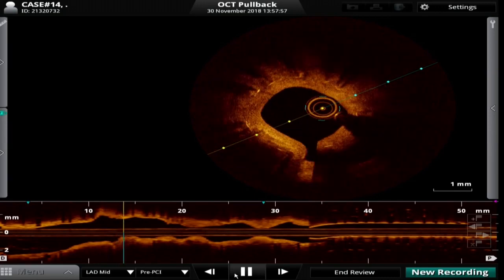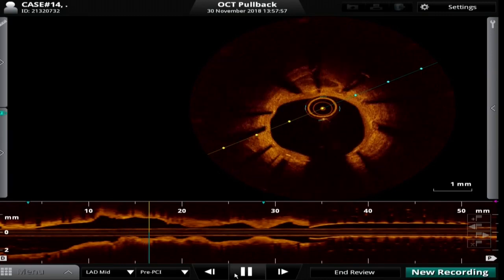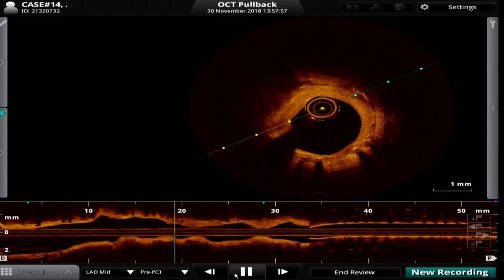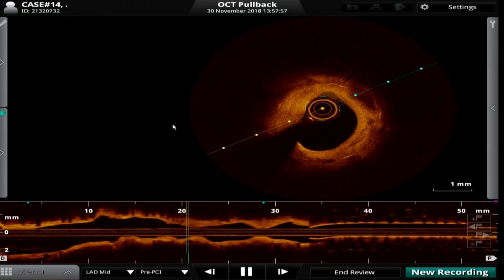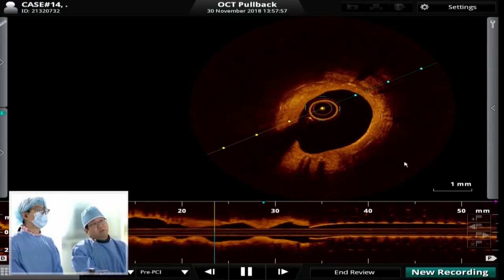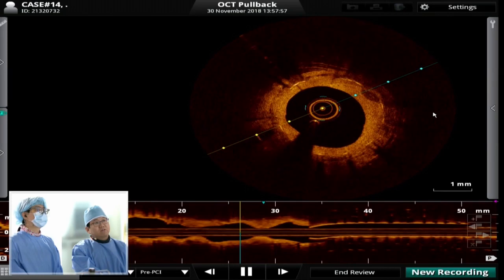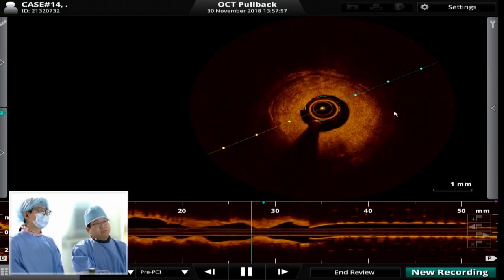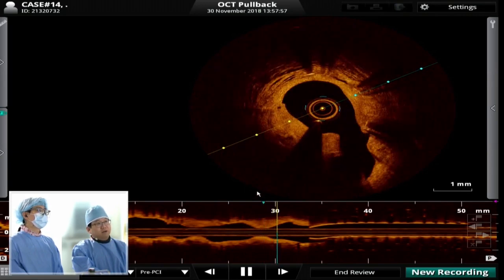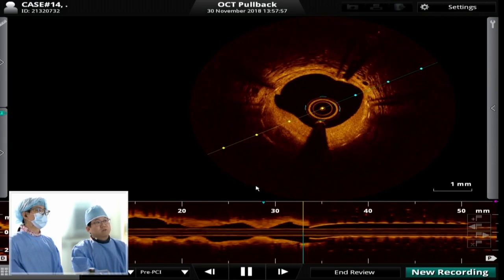The lumen is maintained here, but at the proximal portion of the stent there is some calcification outside of the stent, and inside the stent there is some calcification too, and the lumen is tighter, mainly fibrous tissue. Calcification means neoatherosclerosis. Stent expansion is good? Yes, 3.0, and here is the narrowest portion, mainly intimal hyperplasia, right? Yes. At the proximal stent edge, the lumen is good.